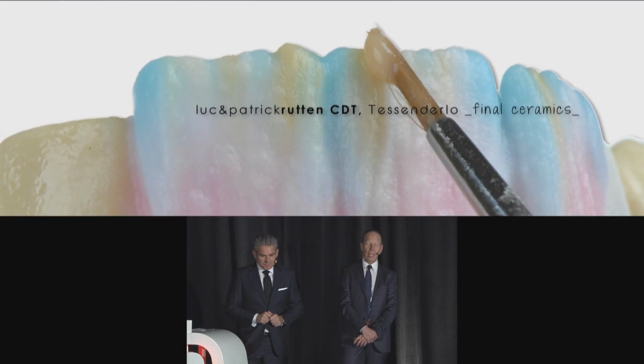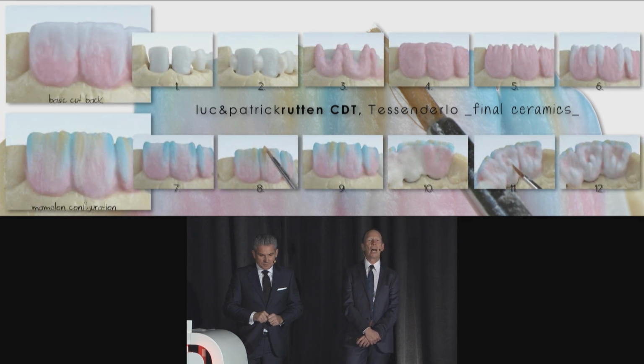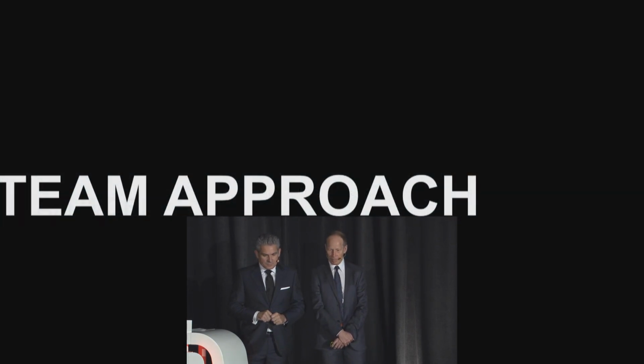And then of course we do the layering. This is something that we do mostly, not all the time, but mostly in the lab, and then we take all the work and we fly to San Sebastian to finalize, to fine-tune the restorations. Here you can see step by step what we are doing. We are building up what we see, we try to copy with the right powders, of course. This is then the bisque bake, and then it's time to pack and fly from Brussels to Bilbao, and then Bilbao to San Sebastian.